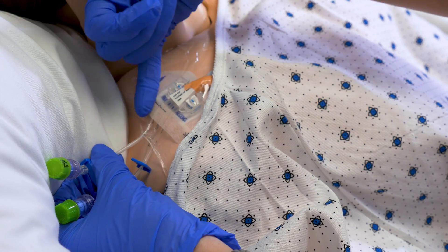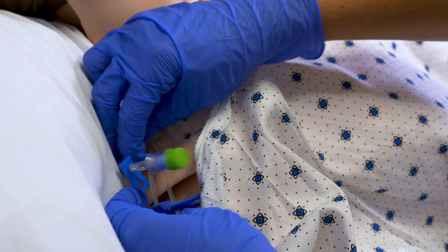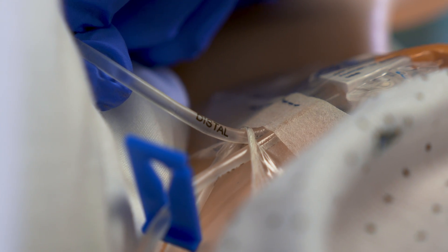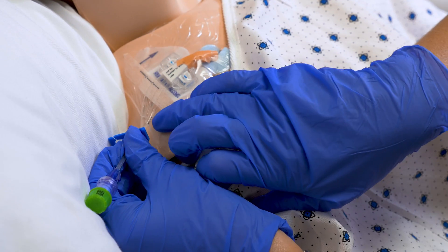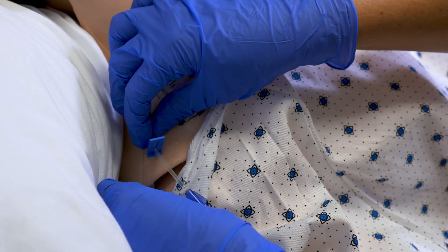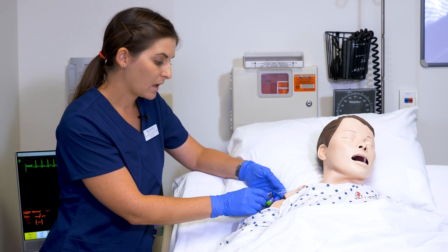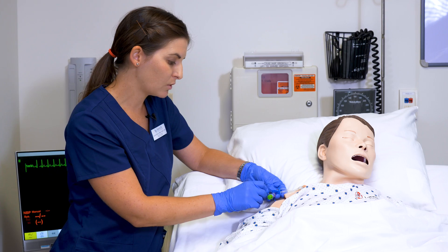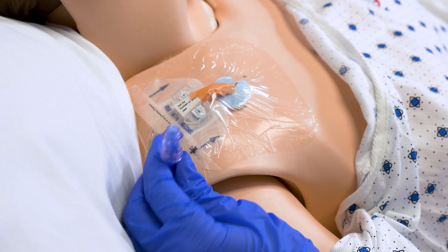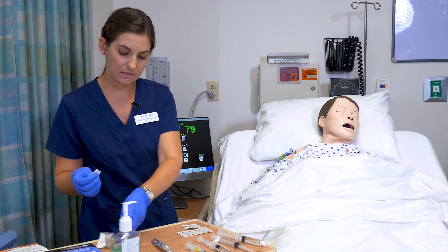The port labels are written on the actual lumen and catheter. This one says proximal, this one is distal, and this next one says middle for medial. It also tells you the priming volume and the size of the catheter so you know how much to flush. I am going to use the medial lumen, and I am then going to scrub my hub with alcohol for 15 seconds.